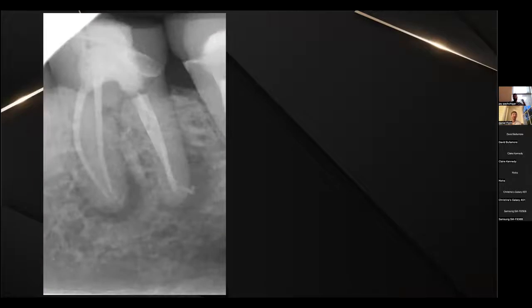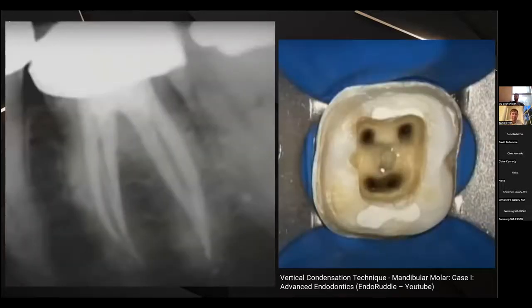When you look at the amount of tooth structure that's removed, I think we're lucky now that the materials we have, with the heat treated nitinol, allow us to be a lot more conservative. For sure. One of the issues traditionally with the instruments that we had is that they were so stiff that in order to get around the apical curves, we had to be a lot more aggressive with the amount of tooth structure we removed. So it was a balance with those stiffer files. You only really want the bending once, so you definitely needed your straight line access.